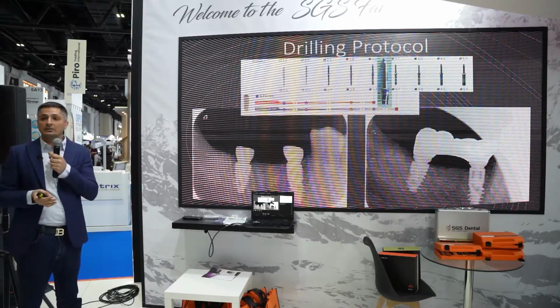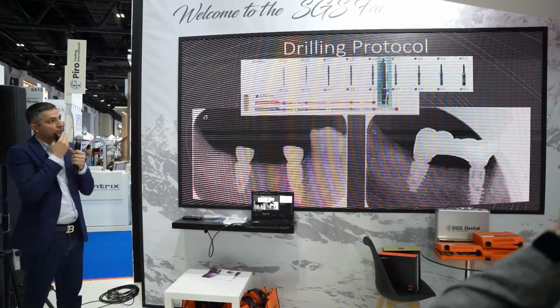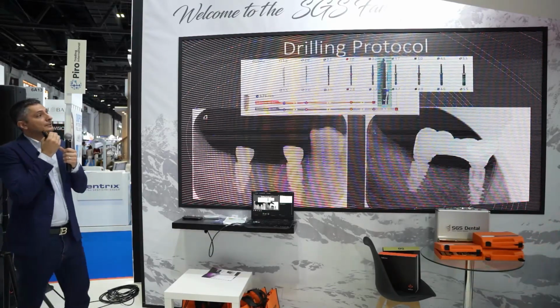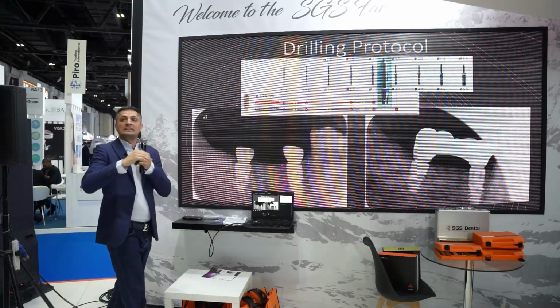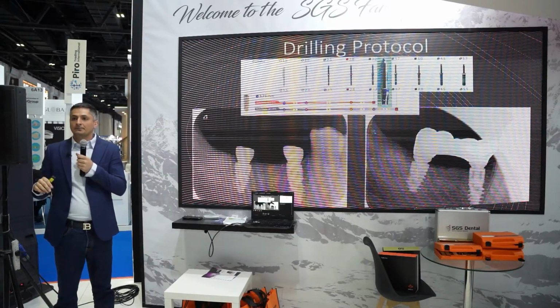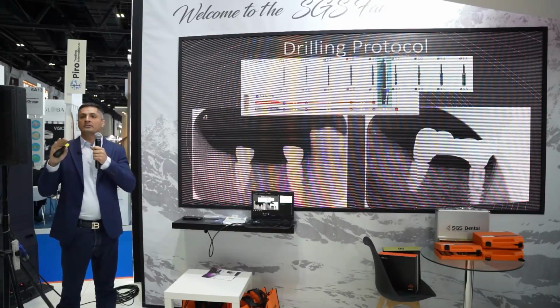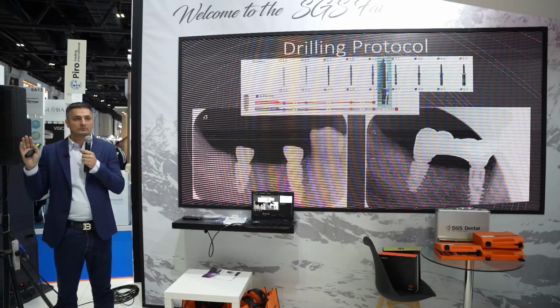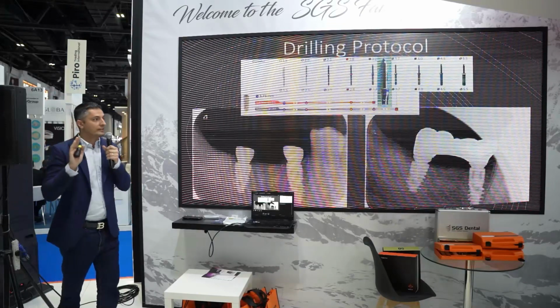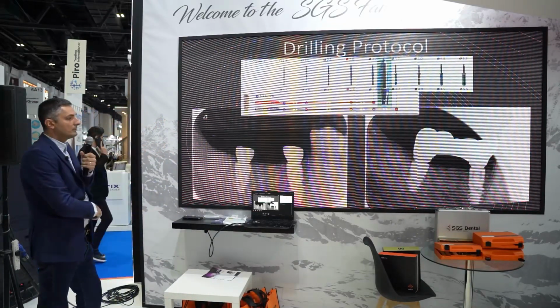What I'm doing now, I'm using the 3.7 that you said to me that. The 3.7, we can use it till 6 millimeter depths, till 8 millimeter depths, it's okay. You will have an insertion torque about 25 to 30 Newton, which is great for us. Very good. This is a case in the mandible.